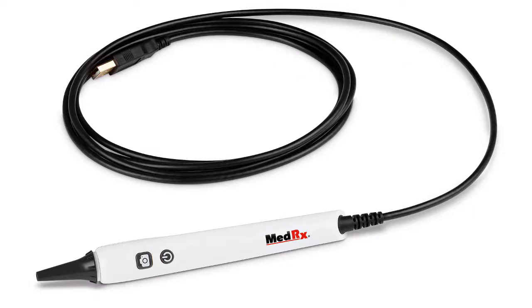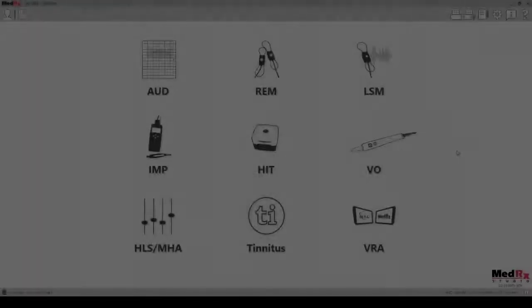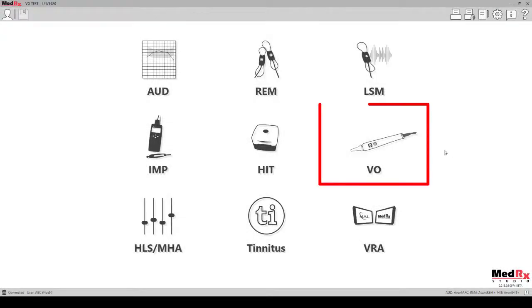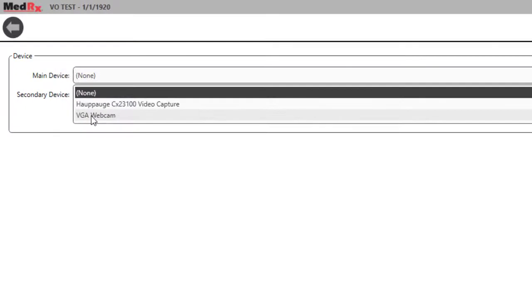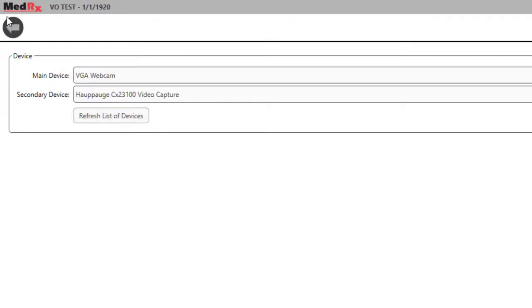Make sure your video otoscope is plugged in and turned on. In the Studio software you will want to click on the VO module. You will first want to configure your otoscope. Click on the settings icon at the top of the screen. From the drop down menu you can select your otoscope, then hit the back button.